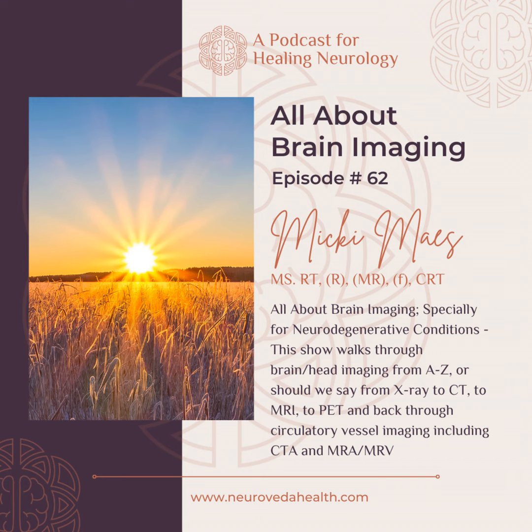However, the most exquisite soft tissue detail is going to be seen with magnetic resonance imaging or MRI. So MRI uses magnetic fields and radio waves to look at hydrogen atoms. And you can look at any part of the body with that. And it can detect the same kind of things as CT scans, but it's really exquisite for soft tissue. So certain conditions, specifically brain atrophy, brain damage from basically anything, small strokes, subtle ischemia, MRI is really wonderful. So that's the go-to for most brain images.